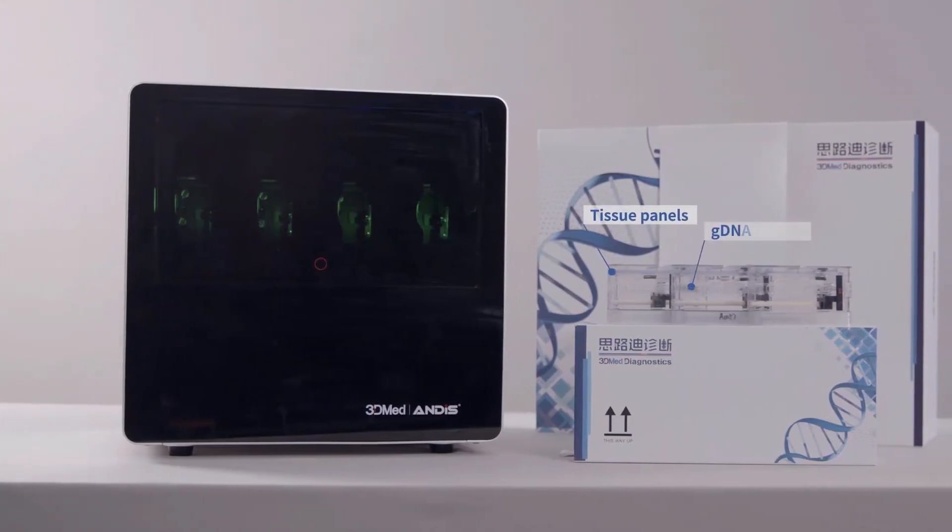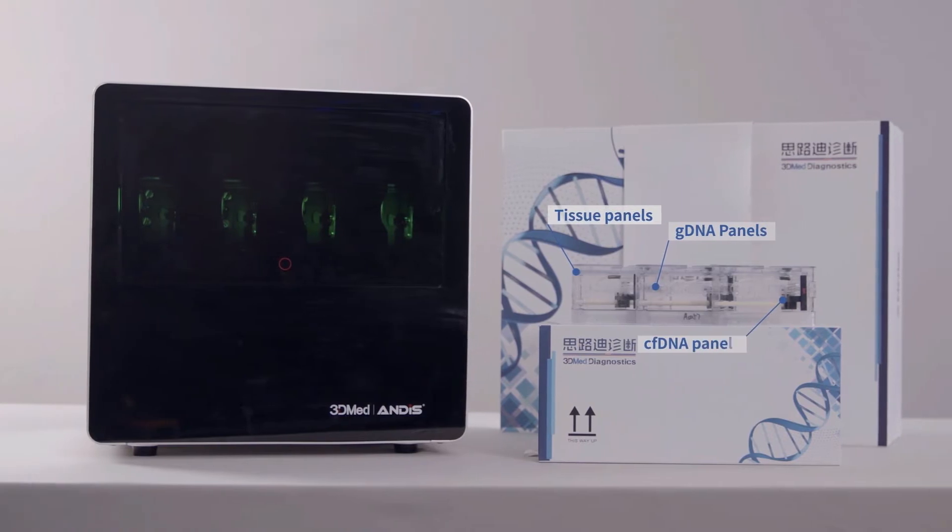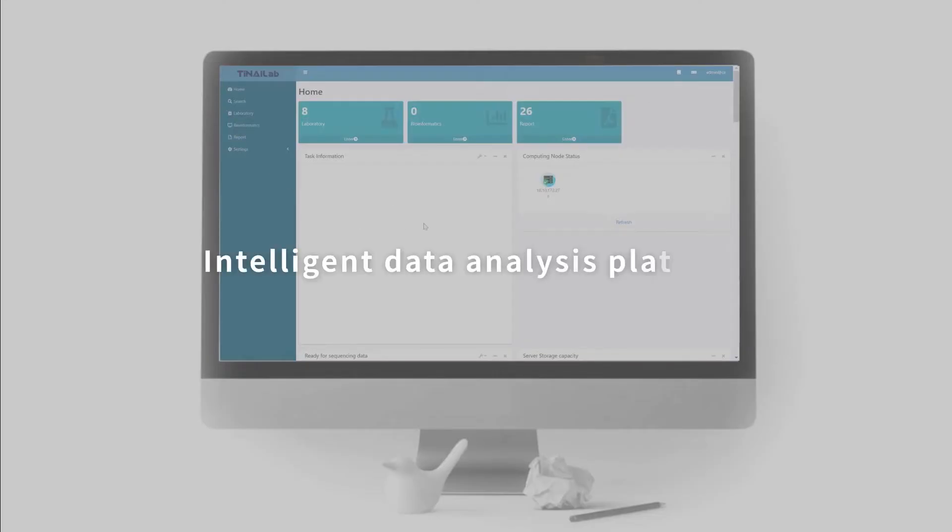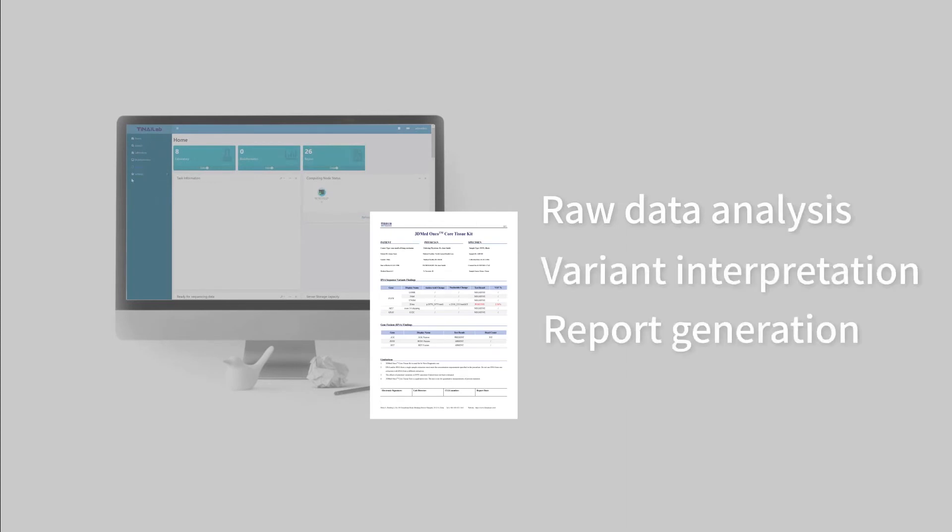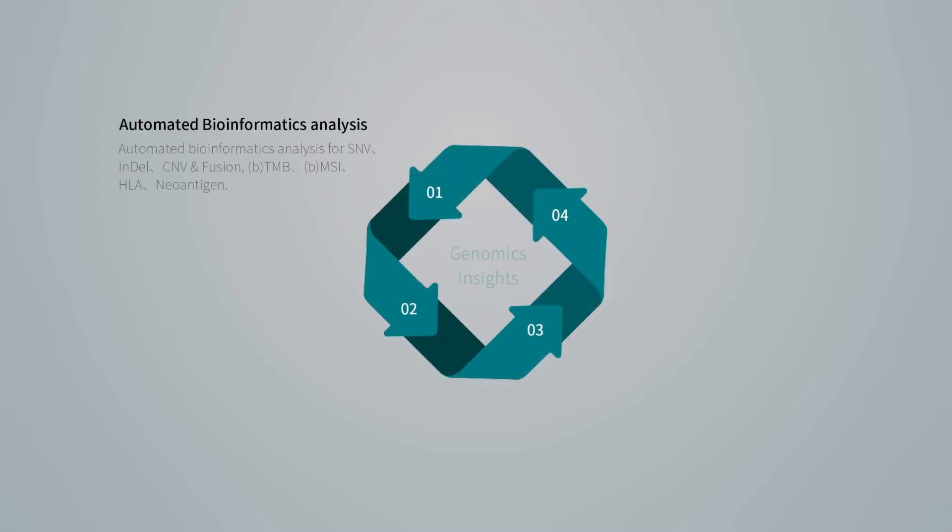3D MAD provides comprehensive cancer panels for solid tumors. TINA system is easy to use for sequencing raw data analysis, variant interpretation, and report generation. With just a few clicks, TINA system enables customers to benefit from 3D MAD NGS bioinformatics capability.